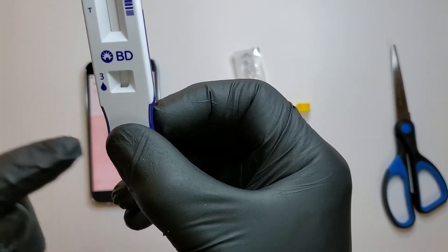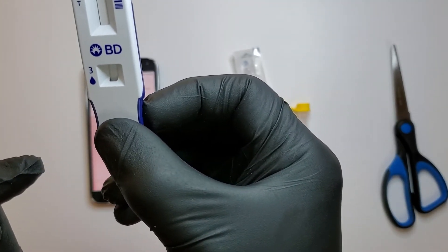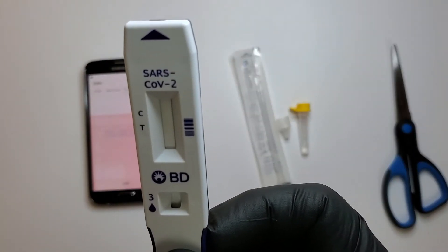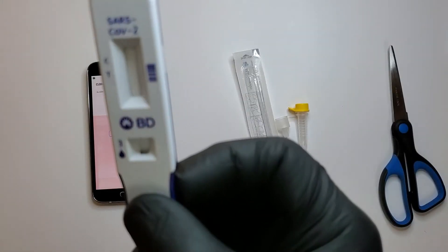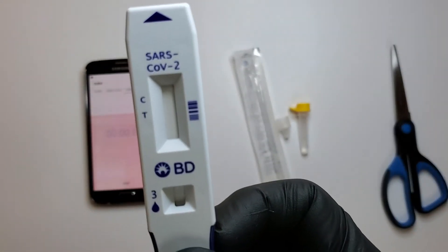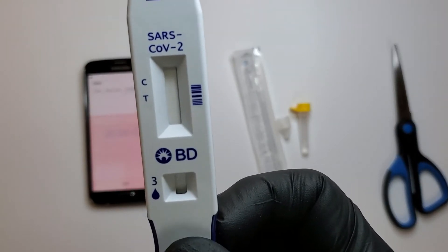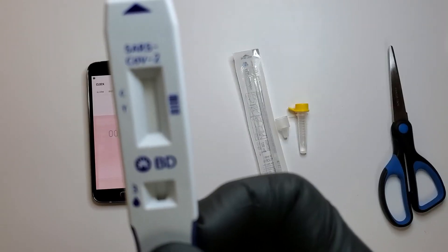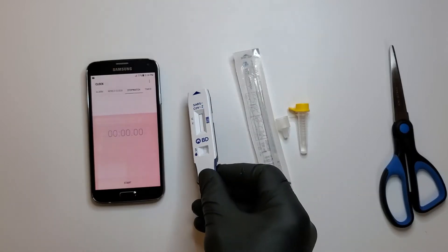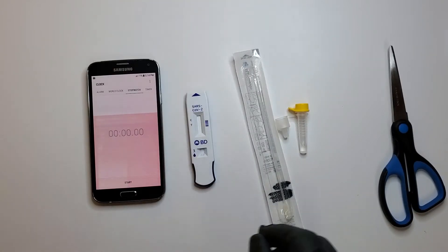And one line at the C alone is negative. They also say even if the lines are faint, it's positive for SARS-CoV-2.